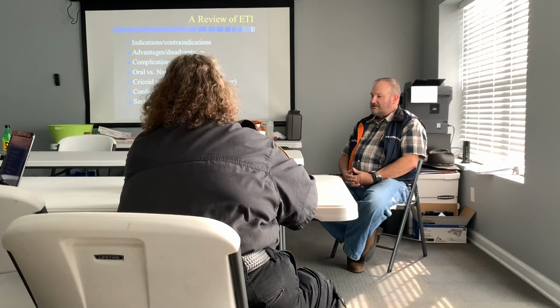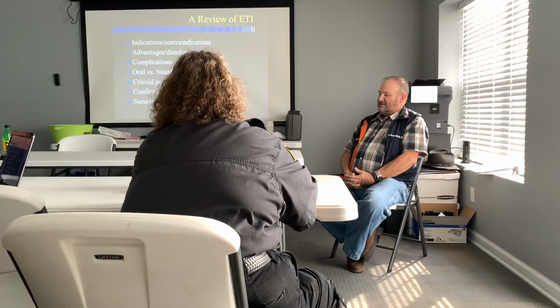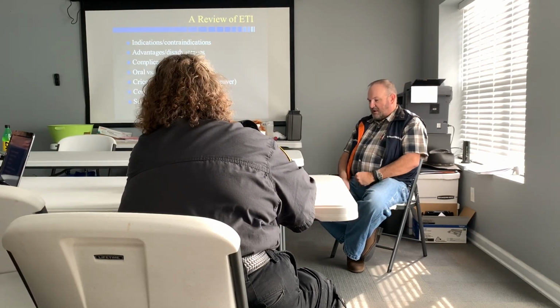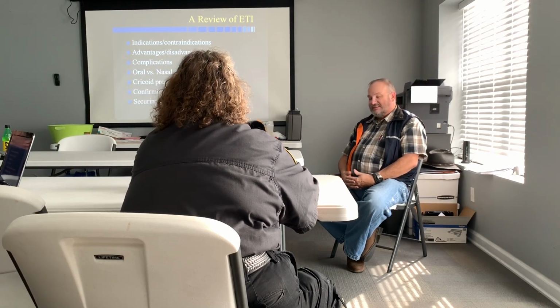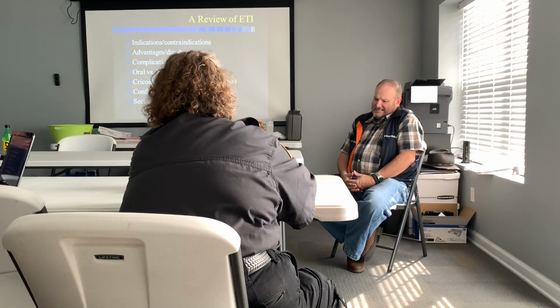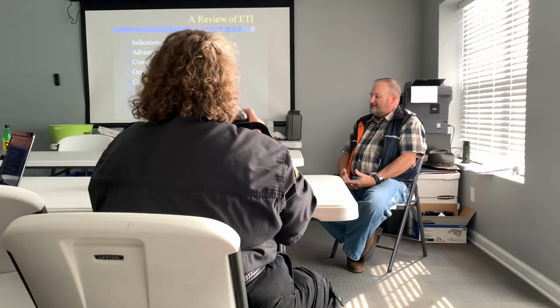The ability to ventilate a patient that's not able to be ventilated, if his teeth are clenched, or he's in a spasm, or he's posturing from a head injury or whatever. Disadvantages, complications. What happens when you don't get it? You try to put the tube in and it's not there.